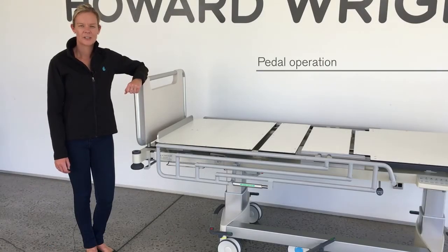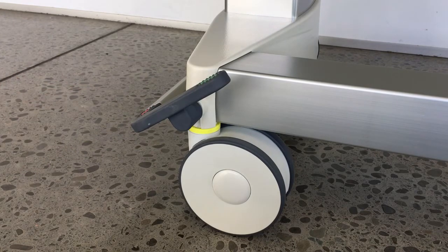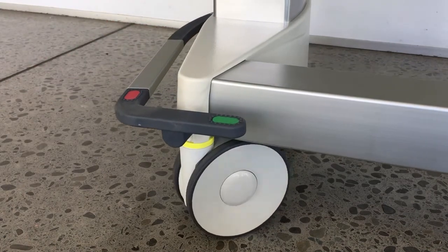Caster pedals can occupy three positions: brake, neutral, and steer. To engage the brake, press the red pedal. To engage neutral, set the pedal to a horizontal position. When set in neutral, the bed can be manoeuvred in any direction.